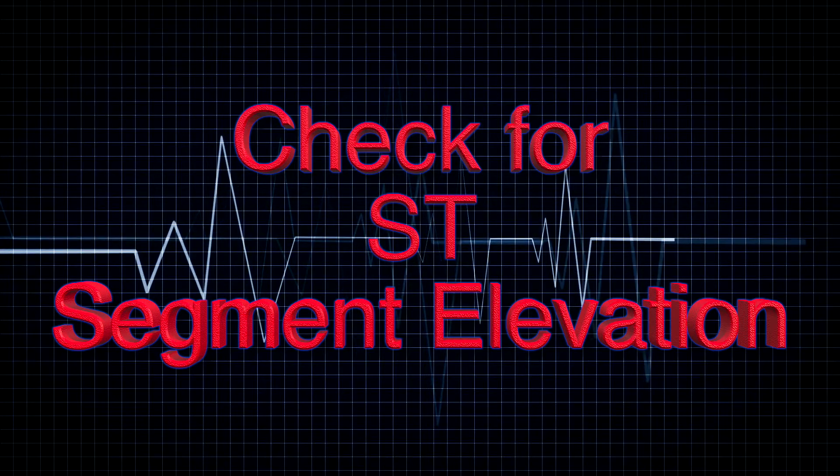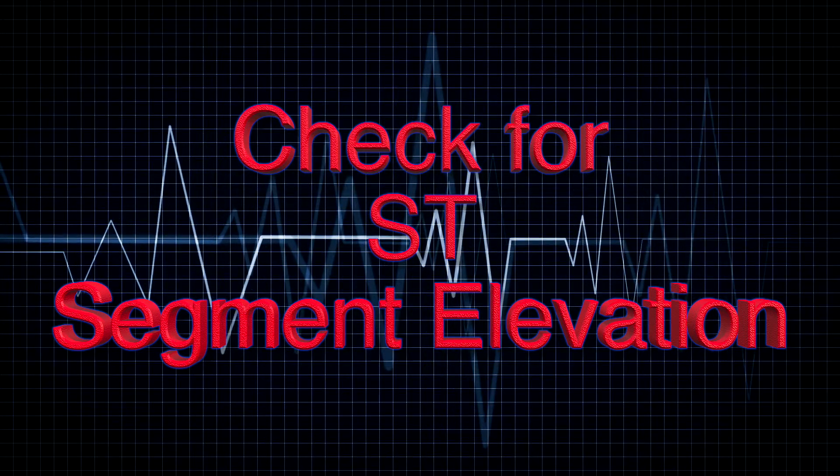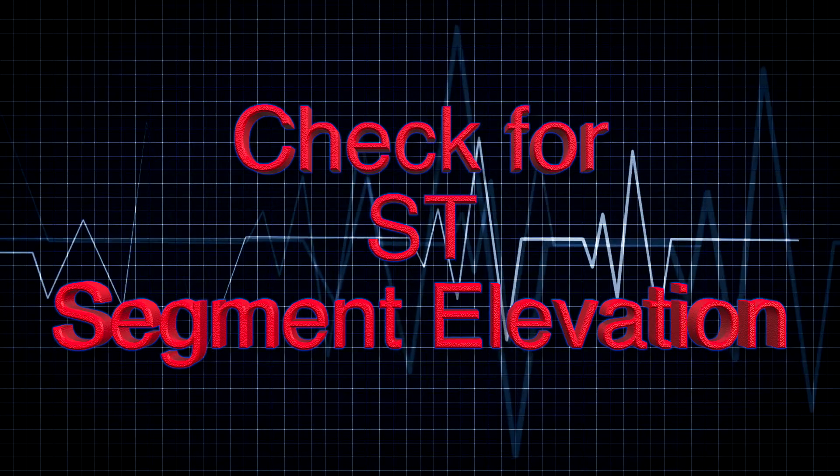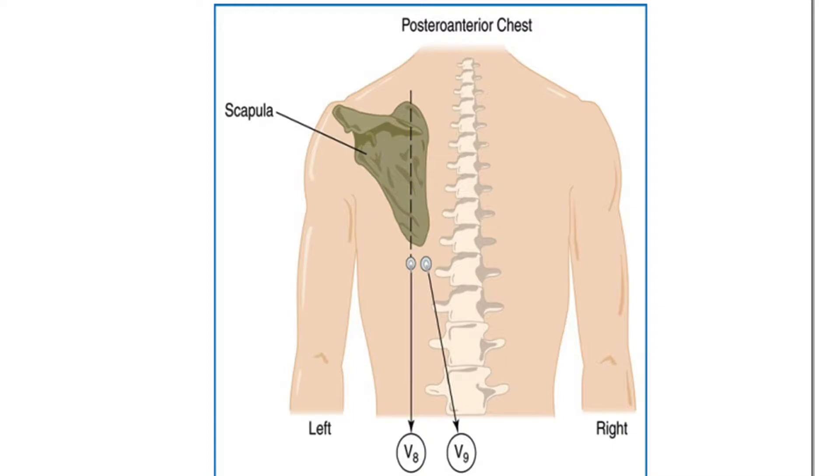Now that you've got your 12-lead EKG, make sure you read it and check for any ST segment elevation. Check for any abnormalities as you normally would. After that, we want to get a 15-lead EKG — we've got to put eyes on the posterior wall of the heart. In order to look at the posterior wall, we're going to have to put leads on the patient's back.